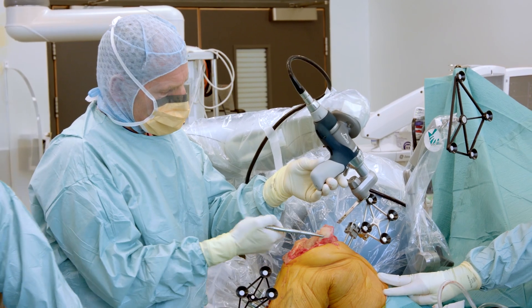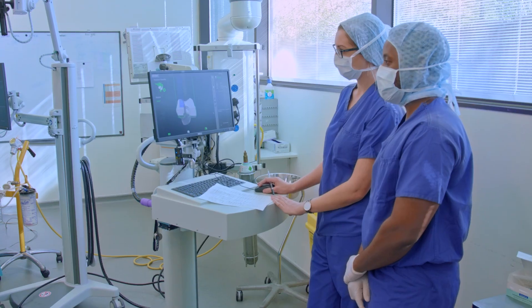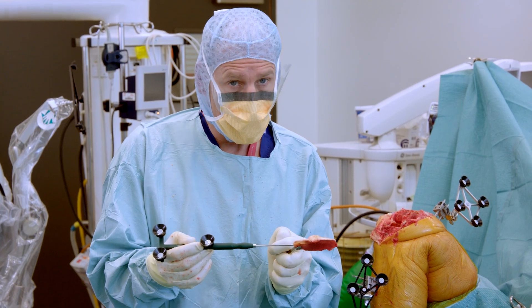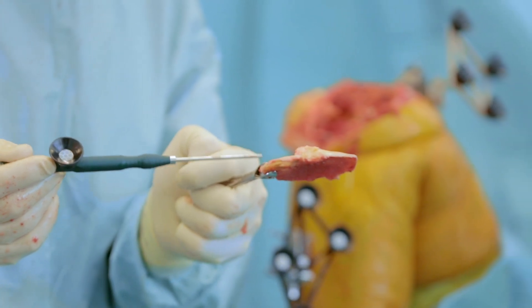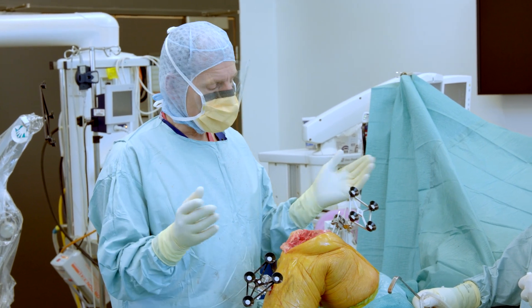I can perform knee replacements well, but what this robot gives me is confidence that I'm putting the knee replacement in as well as I can possibly do it. This is the bone that's been removed from the top of the shin bone — as you can see, only a couple of millimetres on this side, a bit more on that side. That's where all the wear was, so you take less bone off the worn side. And that is what we will resurface. Having seen some of the results when I use this tool, I can put them in better than I've ever put them in before.